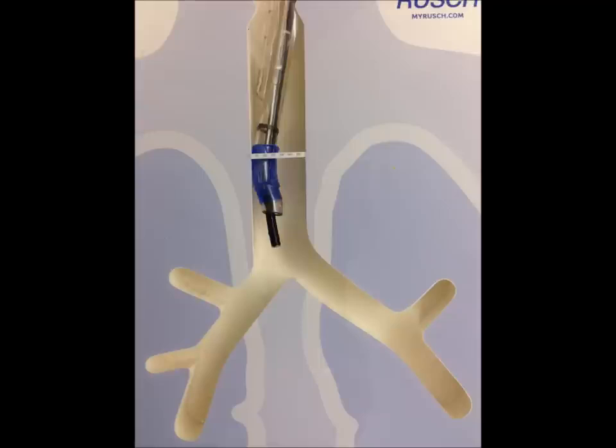When doing this, we like to place the tube in the trachea and make sure that we then pass a bronchoscope through the endobronchial lumen. This is again a left-sided tube. It doesn't make any difference if you're doing a left chest or a right chest. Doesn't make any difference what side they're doing or what side they want up. This tube works for all procedures, including the dreaded left pneumonectomy. You just have to pull the tube back a little bit before you cross clamp across it.